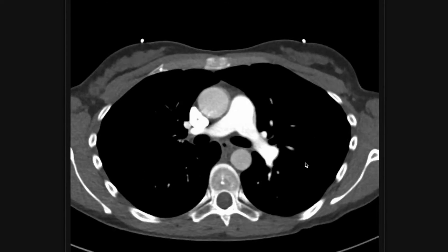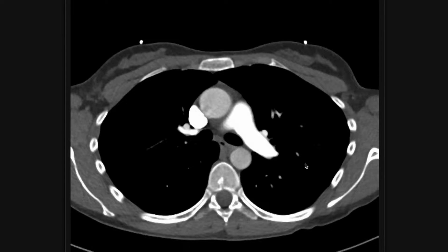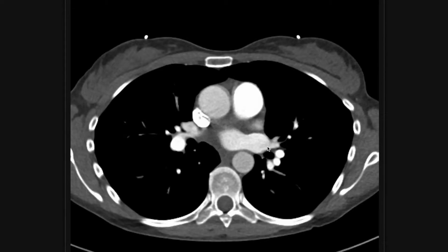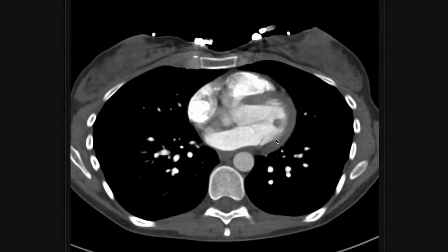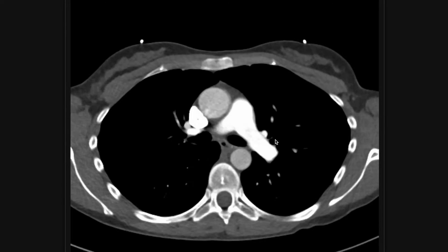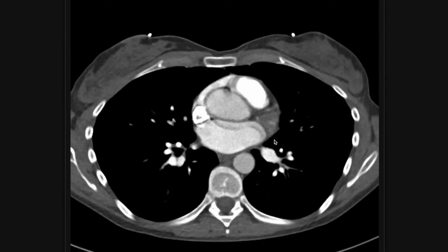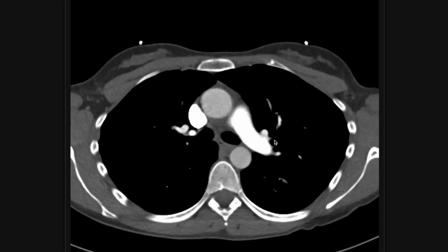I'm going to review my search pattern first, and then we'll look at a couple of cases of positive studies so you can see what pulmonary emboli actually look like. When I read these scans, I go straight to the pulmonary artery and start there, and I search through all the pulmonary arteries to find the PE.